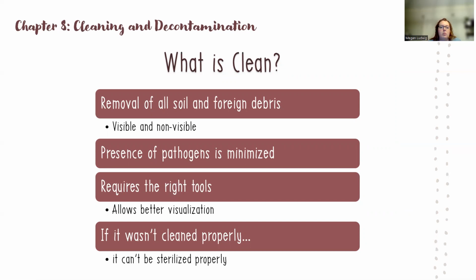You're going to go through that process of the washer decontaminator. That makes it clean, okay? So sometimes you can't even see it, but it still goes through the washer decontaminator, and we can then call it clean, safe to handle, right? We are reducing the pathogens by making it clean, but it doesn't necessarily negate the pathogens. There's still going to be some present, just like any surface that we touch throughout our house. It is clean, hopefully, but it is not sterile.